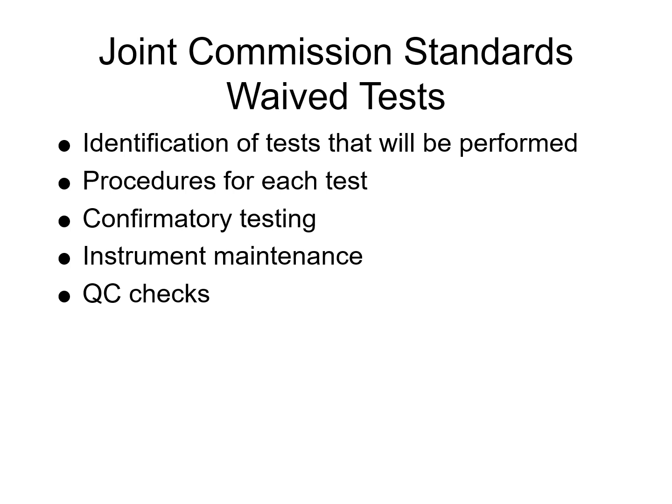Just some best practices. So we want to make sure we maintain an up-to-date test menu accessible to all personnel. We want to follow written procedures strictly to reduce variability. And we want to make sure we record or document all QC activities and instrument maintenance in the laboratory logs.